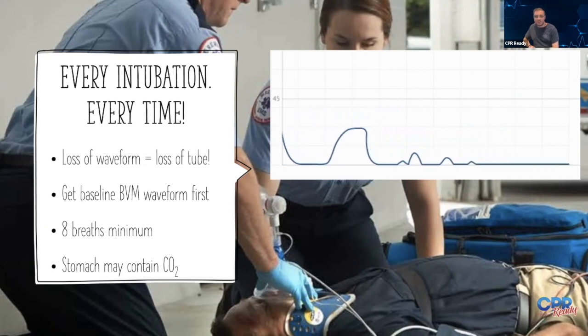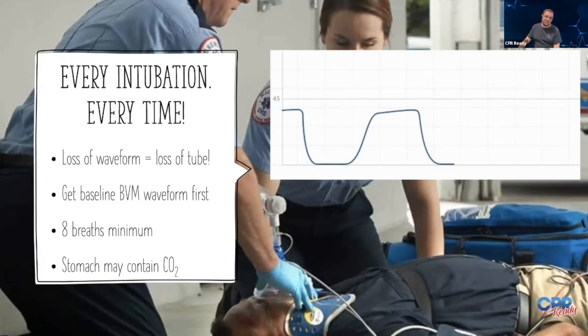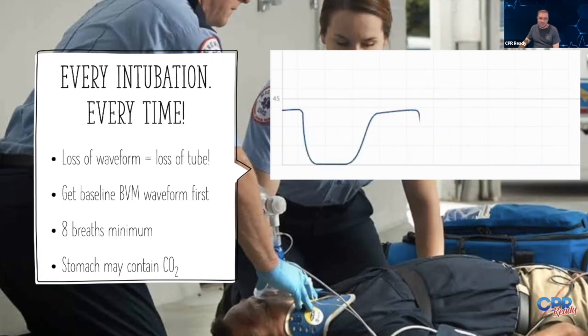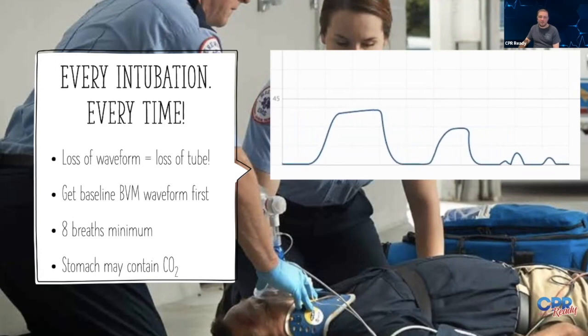Whether it's an ET tube, a King airway, an iGel, you should be able to hook this up to your monitor. Just remember, if they're in a low perfusion state, then it's good if you could probably monitor this before you intubate them so you get a good baseline, but you should still have a present waveform. If you lose that waveform, you gotta reassess that tube, and you gotta assume that it's come out. It may have been the best intubation you've ever done, and you swear you saw it go through the cords, and you know it's there, and the lung sounds sounded good, but things happen. Things get dislodged. Never, ever, ever show up at a hospital with an esophageal intubation. There's just no excuse for it.